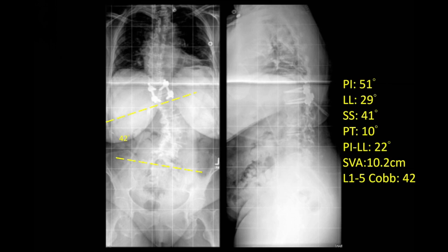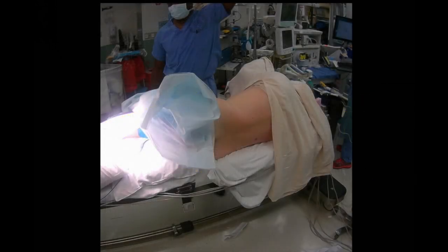On the right are shown the spinal pelvic parameters. An oblique lumbar interbody fusion is planned for three reasons: first, to help correct the coronal deformity; second, to enhance arthrodesis; and third, to address the lateral listhesis that is seen at L3-4.